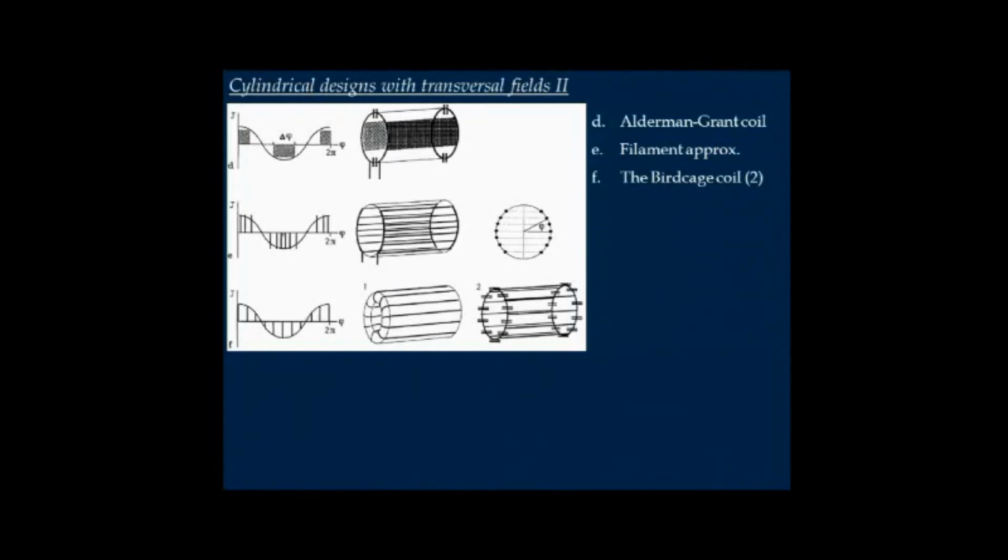And now we come to the coil, or the most used coil, which is the birdcage coil. Its predecessor has a very smart idea where the cable length and the cable itself is wound around a toroid cylinder and has exactly the desired wavelength, so that within, it's now using the standing wave effect. Within, on the inner side of the cylinder, you produce exactly the desired sinusoidally modulated current density, and the outside elements work very well as shieldings.